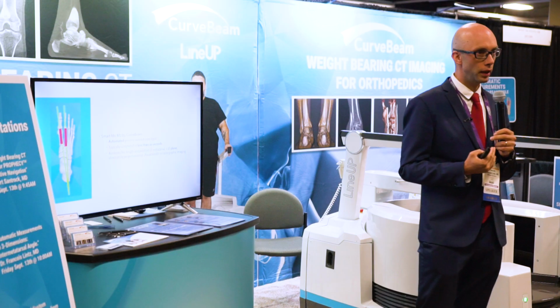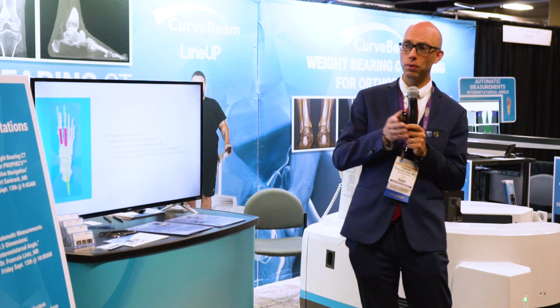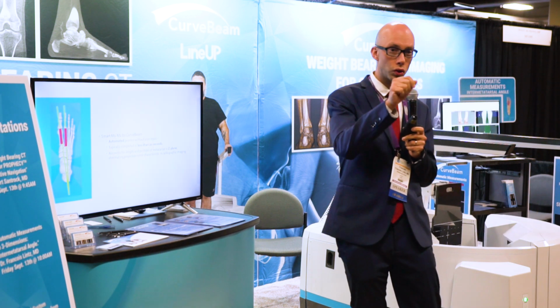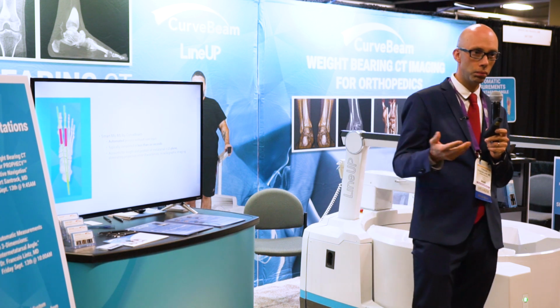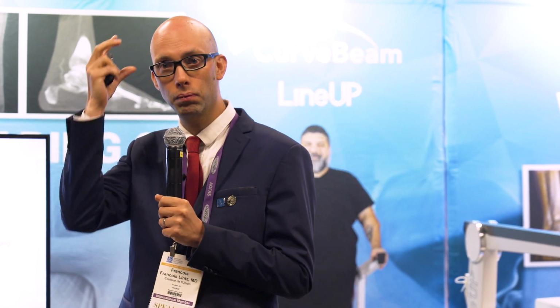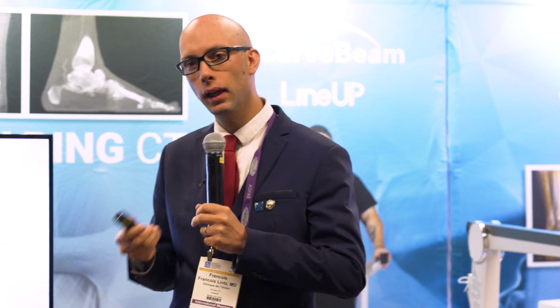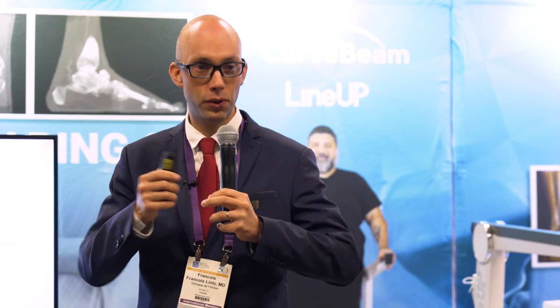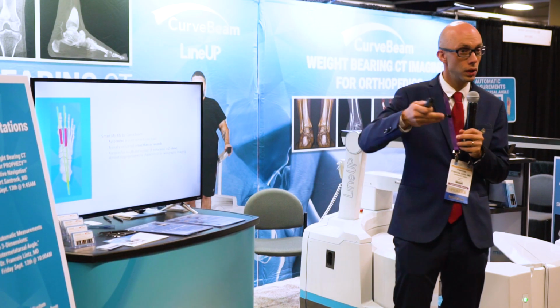What we've chosen to do is to produce a measurement which is similar to what we already know. It's very difficult to see in 3D, and we can all relate to that. Some people can draw a square pretty well. We can all do that, but not everybody can draw a cube. It's something that, if you have a nice 3D visual ability, you can do it. If you don't, it's more difficult. So we didn't want to change how we think about hallux valgus, but of course these are developments that will come in the future.